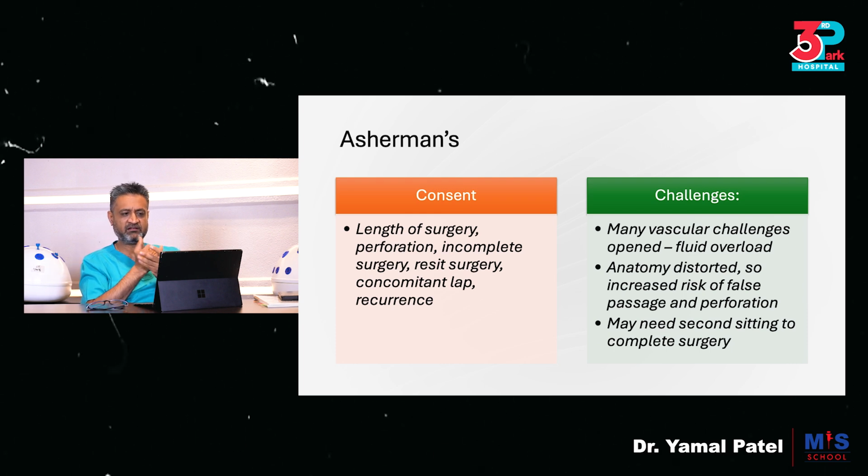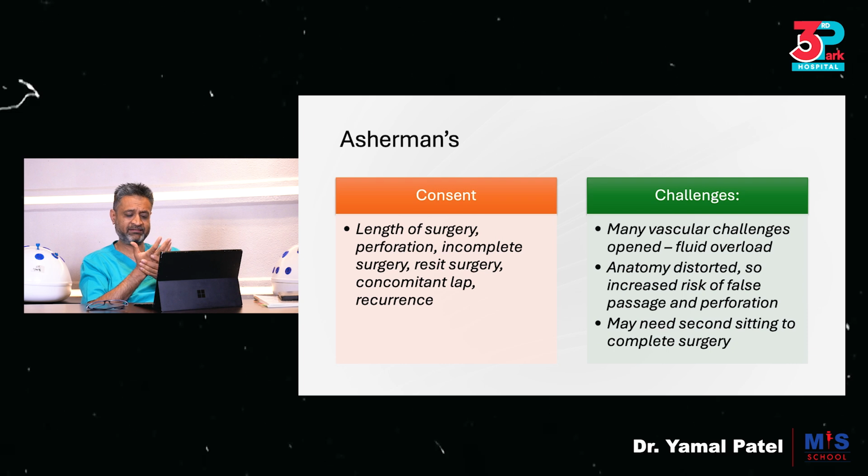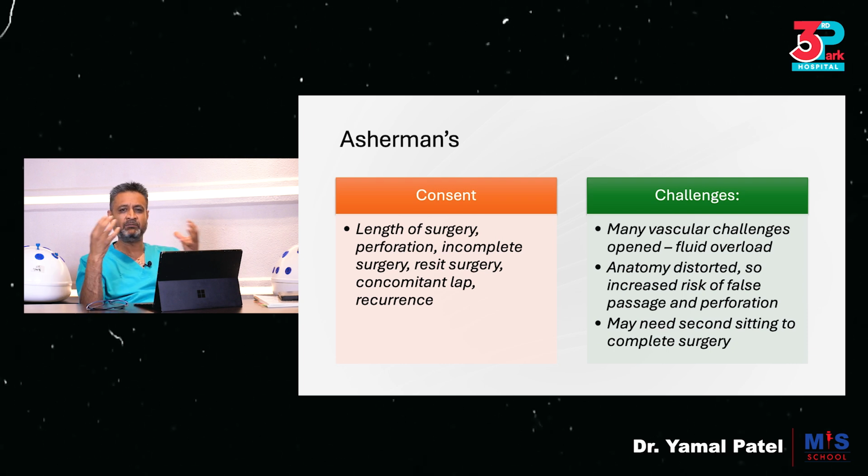I might also discuss with the patient that we might sometimes have to do a concomitant laparoscopy with it. So what does that mean? You have a double setup. You're doing hysteroscopy, but you have a laparoscopy view as well to ensure that you're not going to go into the wrong place or perforate. And if you perforate, then it's captured and you have all the evidence to ensure that you did not injure anything else outside the cavity.